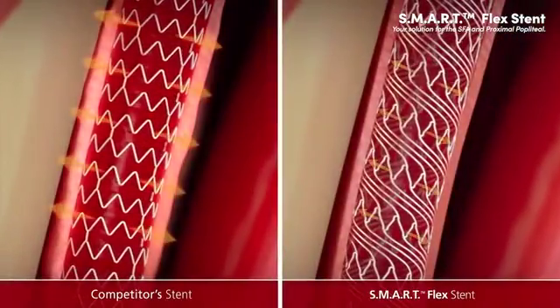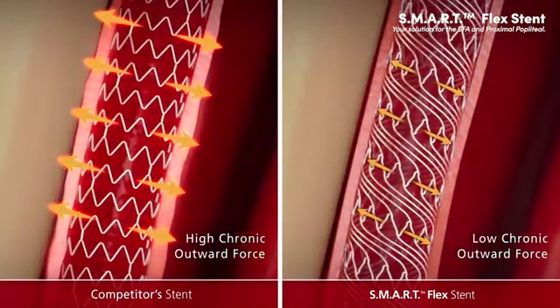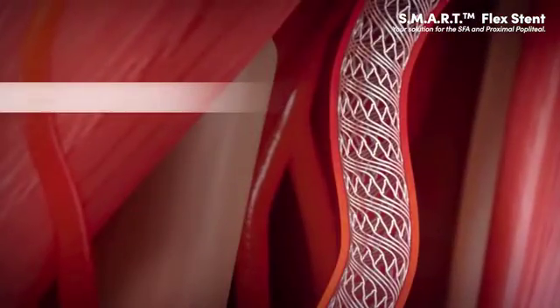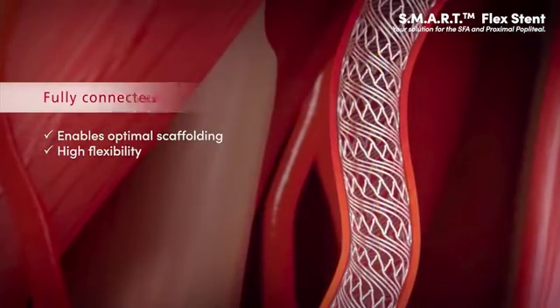Results indicate that a stent design that induces higher stress values on the artery wall may lead to a more aggressive pathobiologic response. Fully connected design and flex bridges also enable optimal scaffolding and high flexibility.